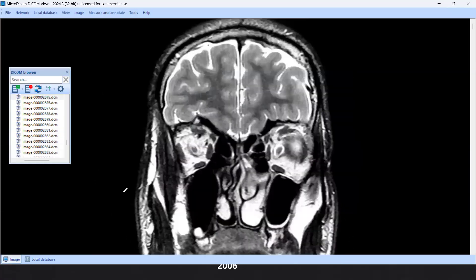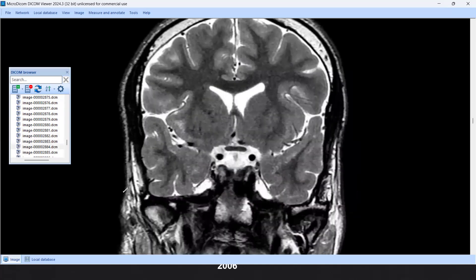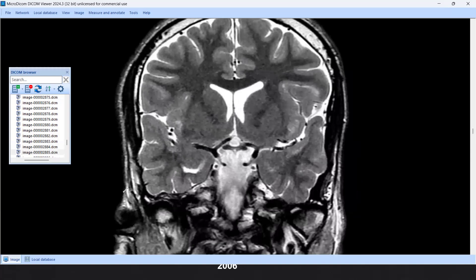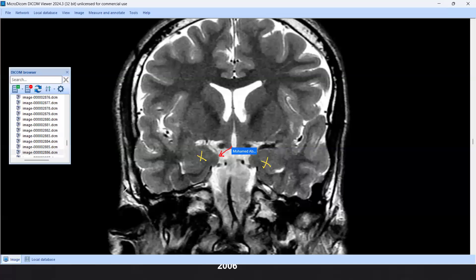Moving to the second important anatomical point: anteriorly we have the amygdala on the right and left — the most medial aspect of the temporal lobe. We also have the uncus, which is the medial border of the amygdala. It is very important to identify the uncus and amygdala.